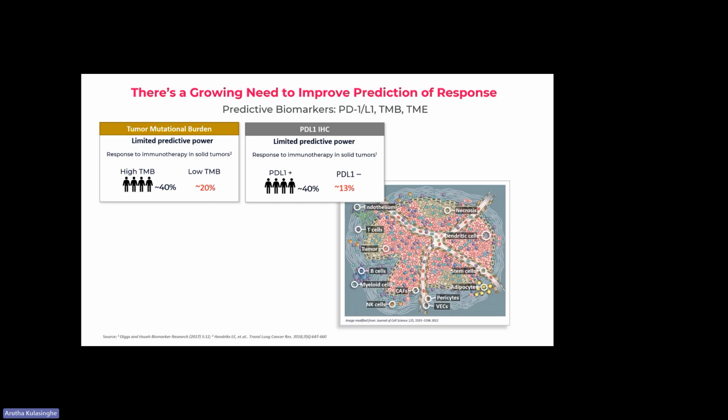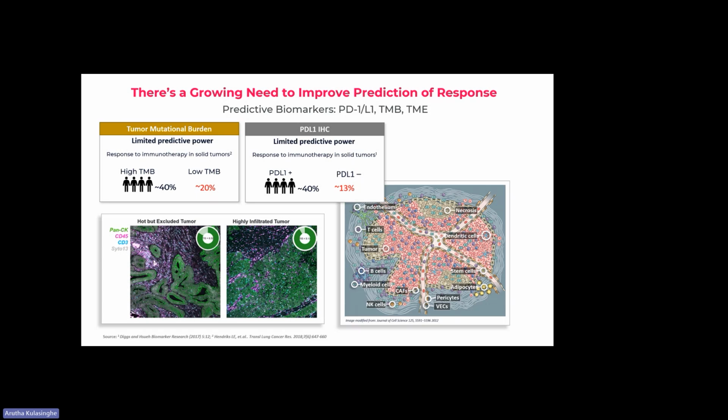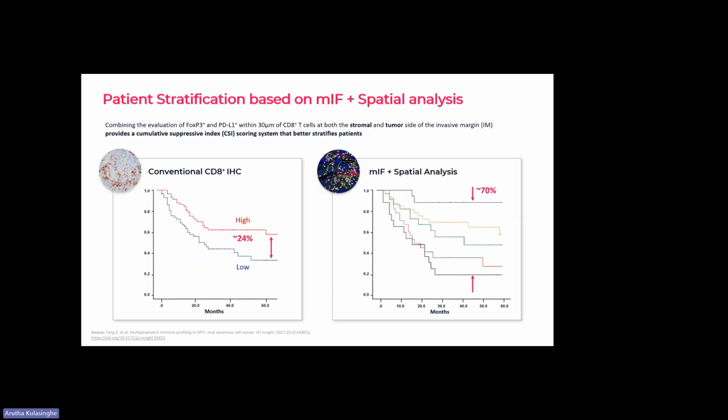So 3 to 5 million cells per sample and map every cell within that. And why this is important is if you look at these two tissues at the bottom left, you'll see the one on the right is highly infiltrated compared to the one on the left. But if we were to grind these two tissues up, they'd have very similar TIS scores or tumor infiltrating scores. So getting that visual data is really important. And at a bulk level, we miss all that infiltration information.